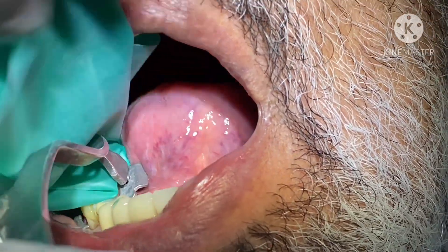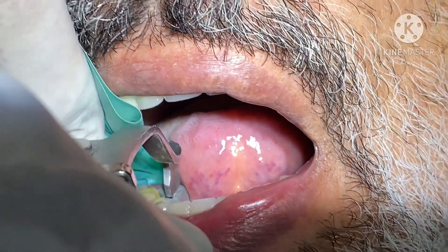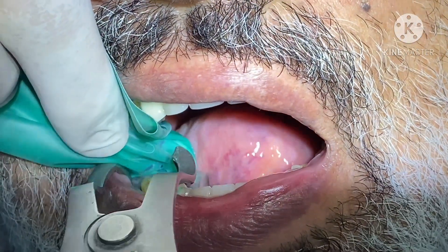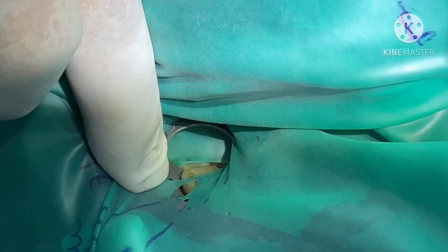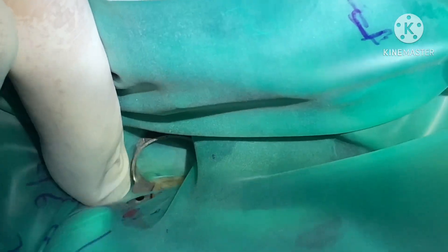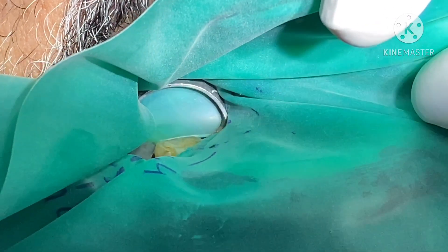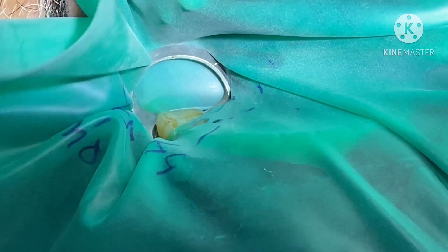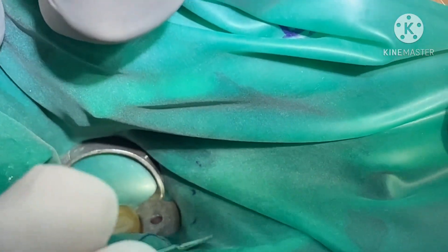Then put it in and be very careful not to hurt the patient because he is not under anesthesia. So we leave it like this. We just stretch it with our hand and try to take it. If it is a hard one, it won't slip. Then the method is to see this hole, take it out, see the flange, and move it.